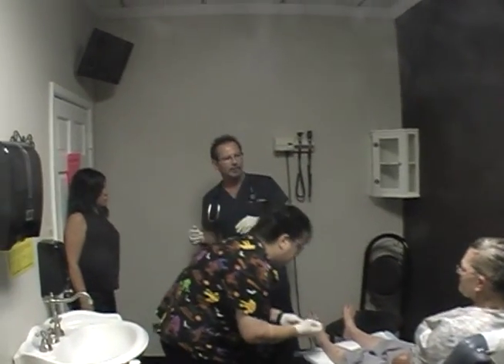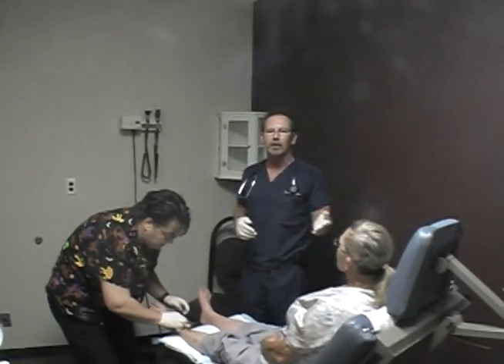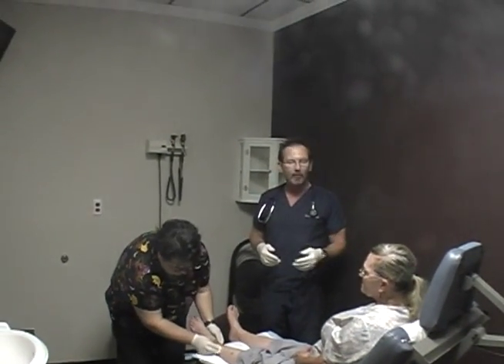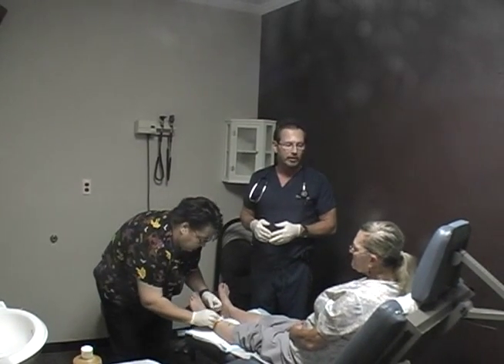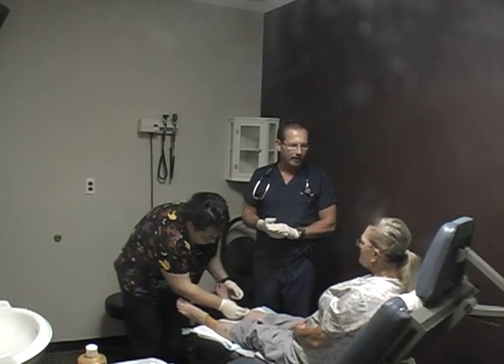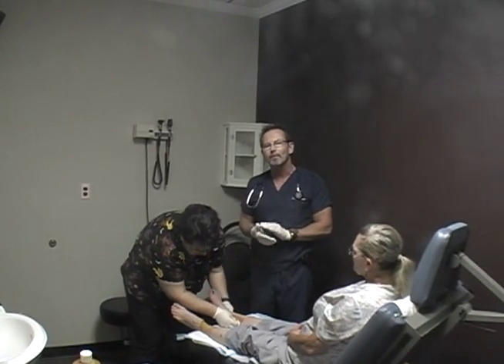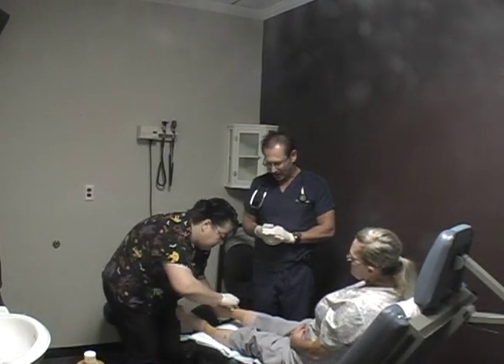Hi, hello, I'm Dr. Ferguson and this is my patient Kathleen. She has been very gracious today to help demo the neuropathy injection procedure. Kathleen has been coming to me for several weeks now and has had tremendous improvement over her neuropathy symptoms.